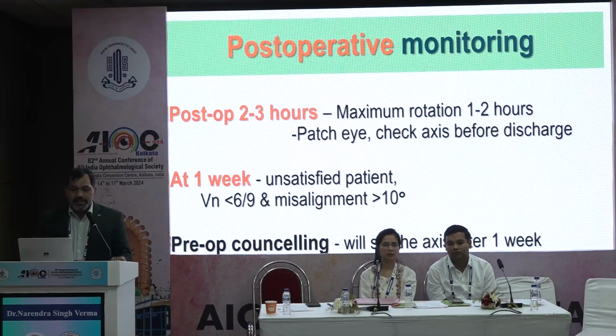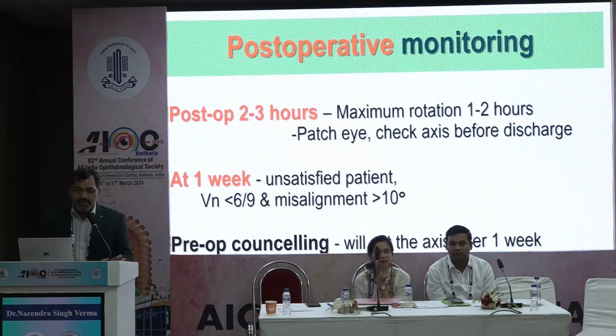Post-operative monitoring: maximum rotation occurs in the first 1 to 2 hours. So you can pad the eye if you suspect that rotation may occur, or if proper coverage of the lens is not there on all sides. Keep the patient for 2-3 hours, then you can discharge.